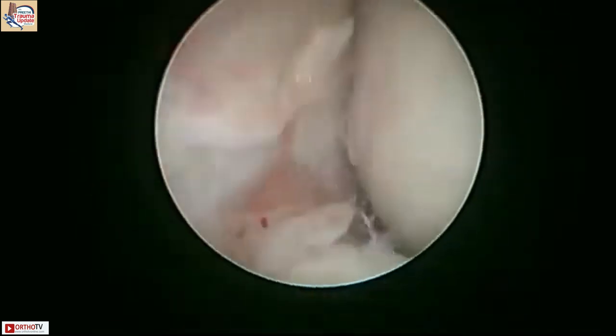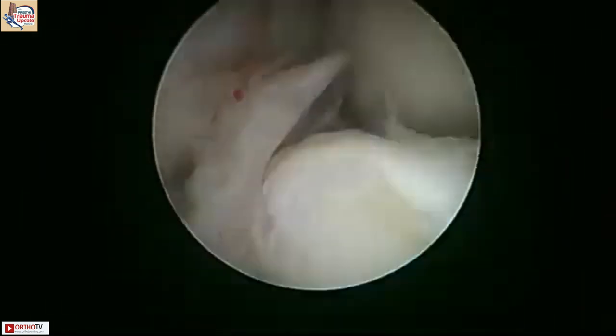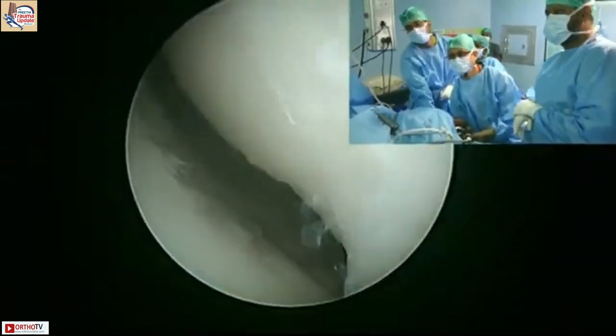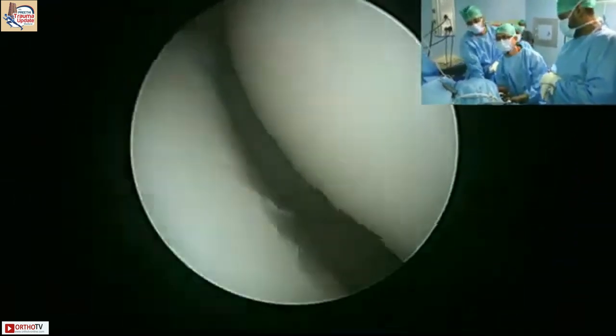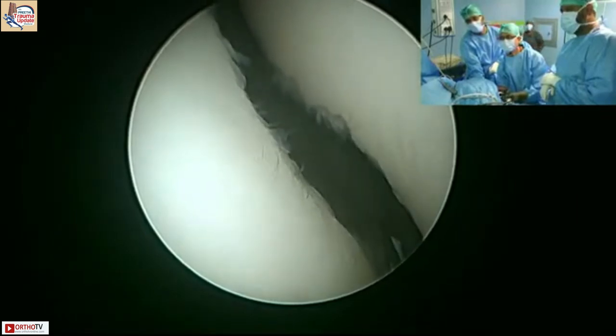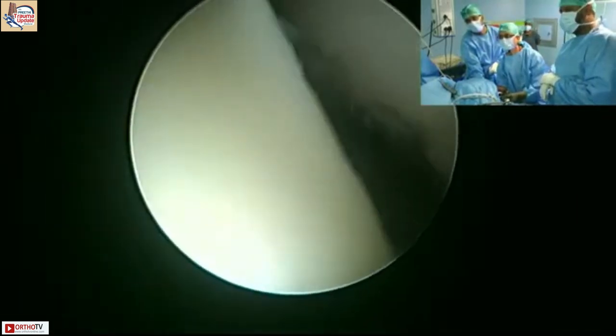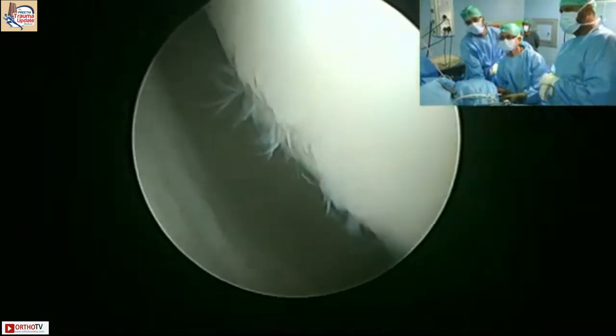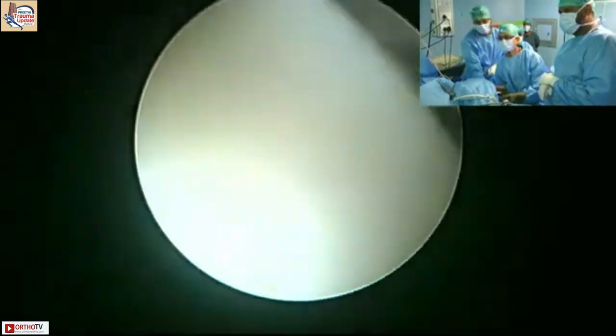That's the capitellum. So if you hold it here, if I look up, you can see the center of the radial head. See that? And you can see the inferior surface of the capitellum. It's already frayed. Now, with the 2.9 scope, you can potentially try and go in. See that? But not advised.